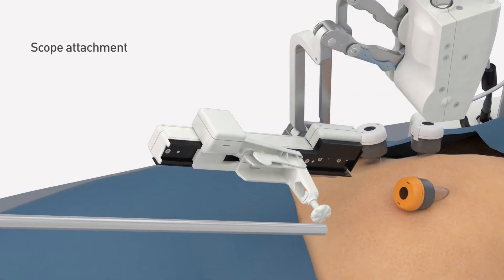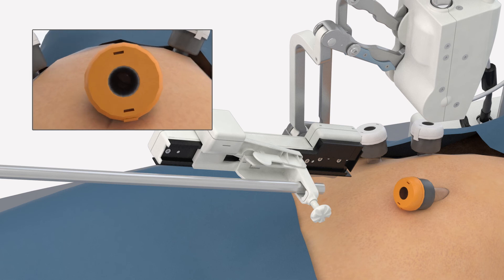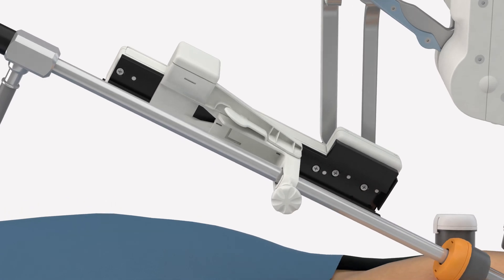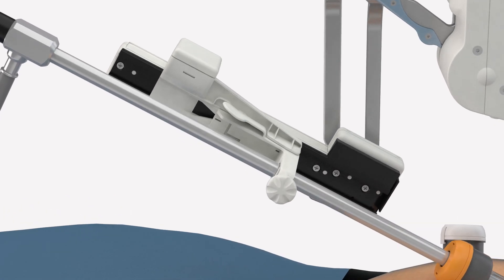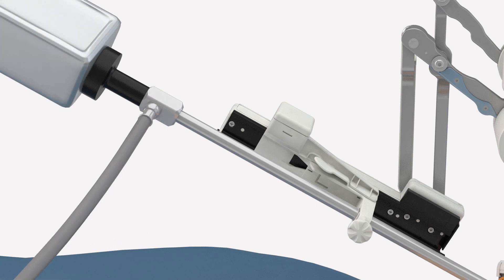The scope is inserted into the camera quick release clip and advanced until its tip is in line with the end of the trocar. The thumb wheel is then tightened to securely hold the scope in place. Manual rotation of the scope will still be possible if required.